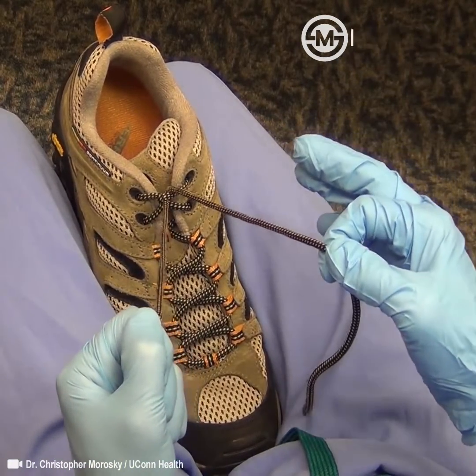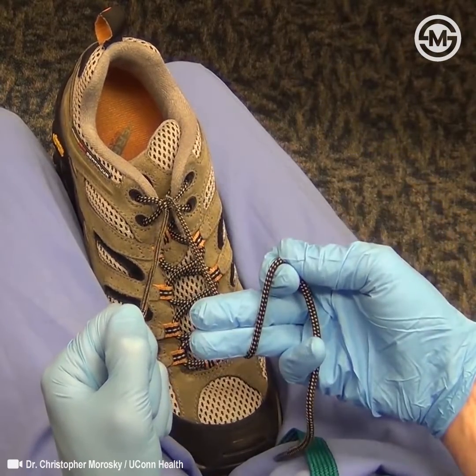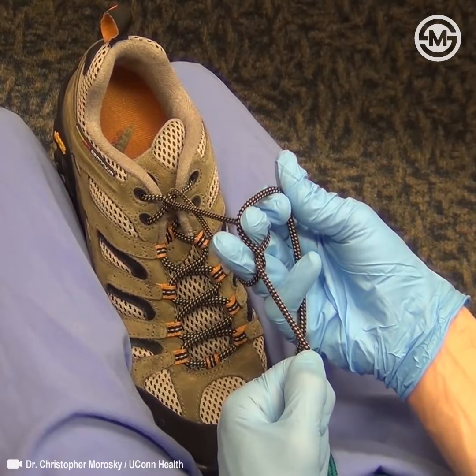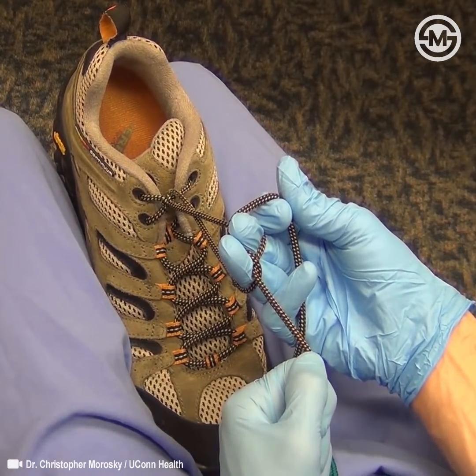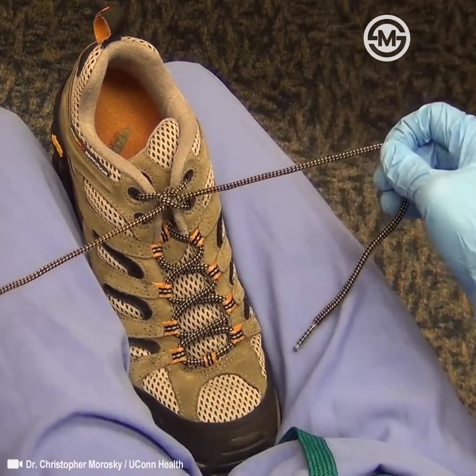So again, slightly sped up: karate chop down — this is an internal chop — bring the loop of suture over, grasp that little part of suture on tension, pinch it in between your middle finger and your ring finger, flick the tail through, pull it down.